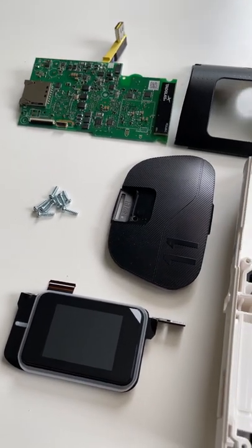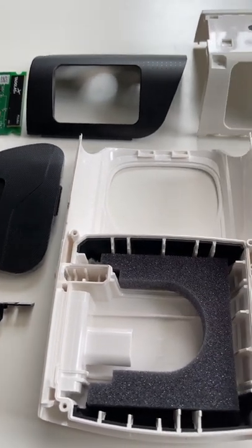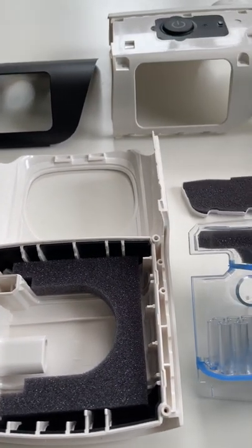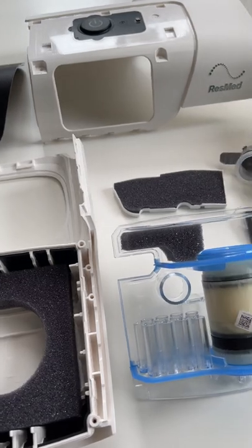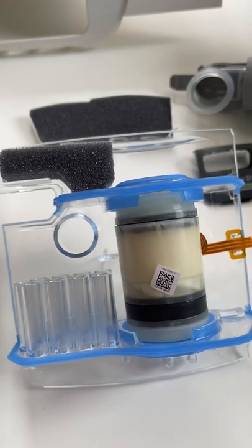Morning guys, just thought I'd give you a quick look at a deconstructed AirSense 11 device. These are all the different components. This is the new turbine, flow generator, whatever you want to call it.